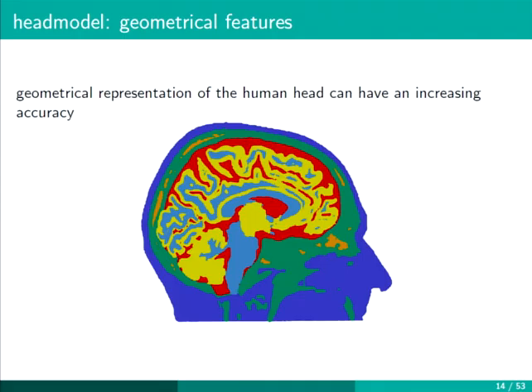Essentially, when planning an experiment, scanning at 1 millimeter takes 5 or 6 minutes per subject and will probably cost you $100 per subject. If you're aiming for higher resolution, T2 and something like that, that usually goes to probably 250 or 300. It's not really much more work, you just need 10 minutes or 25 minutes of the MRI. It doesn't really hurt anybody except for the work.